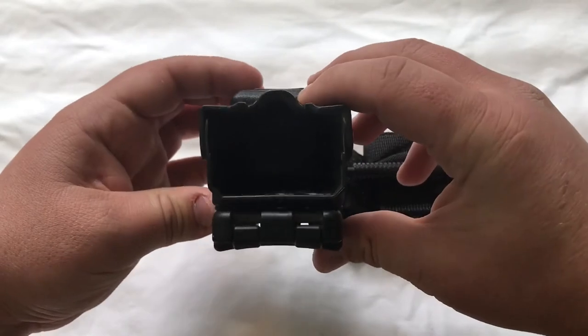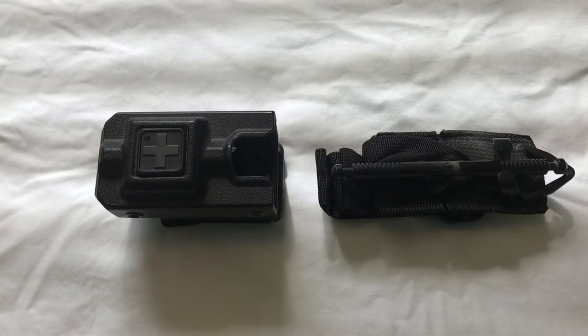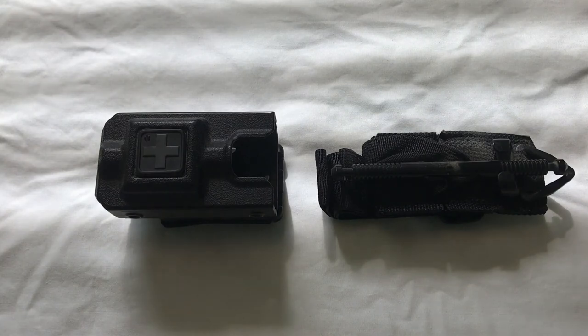That is all there is to it. It's a very simple piece of equipment that works wonderfully. I think every law enforcement officer should be carrying a tourniquet on them at all times, just because law enforcement is typically the very first responders to a scene of an injury, even before an ambulance can get there.